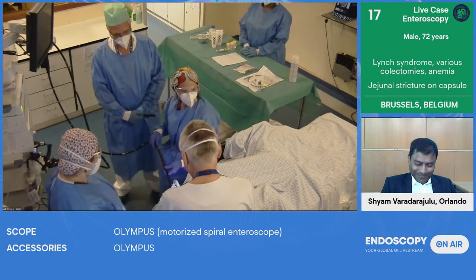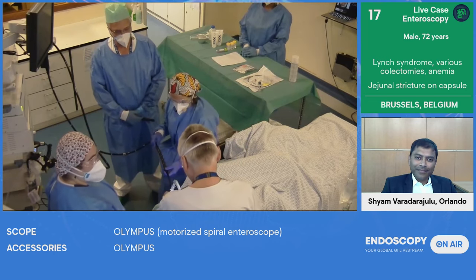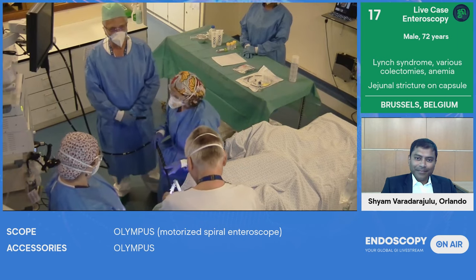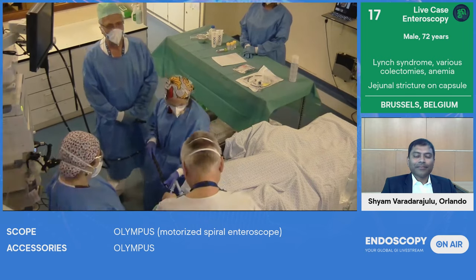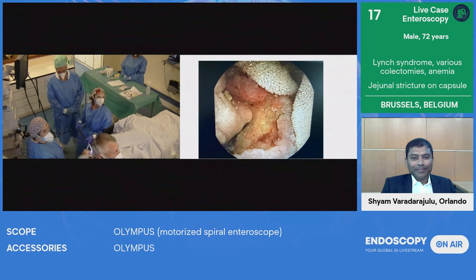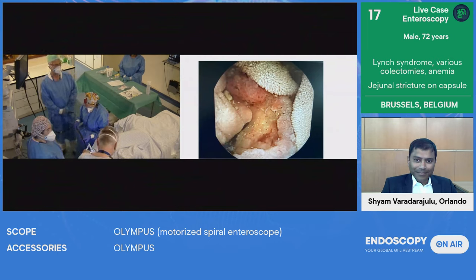So the case here, I don't know if you see the data, the reason why we're doing this procedure. This is a 72-year-old male patient who has Lynch syndrome. He has been operated twice for a cancer of the colon and a rectal cancer, and he has been admitted again for anemia. A capsule endoscopy was performed because the upper and lower were negative.